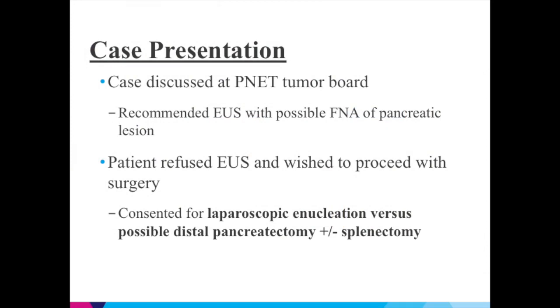Despite the recommendations from our tumor board for an EUS with possible FNA, the patient elected to proceed with surgery for laparoscopic enucleation versus possible distal pancreatectomy.